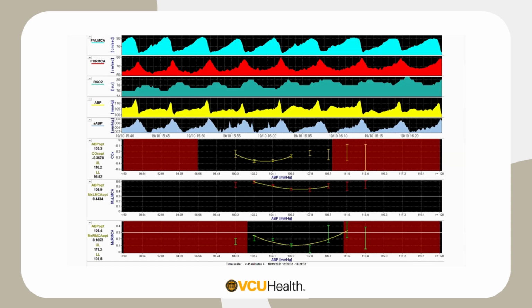We know that brain injury is common. We know that neuropsychological impairments and long-term outcomes are limited in survivors, and even survivors end up having migraines and neurologic sequelae, and increased risk of TIAs. We're completely changing vasculature, and TCDs allow us to get a little bit of insight as to what is going on during that time. So I think there are just a lot of knowledge gaps that we have.